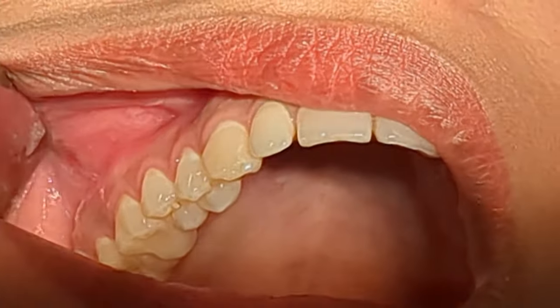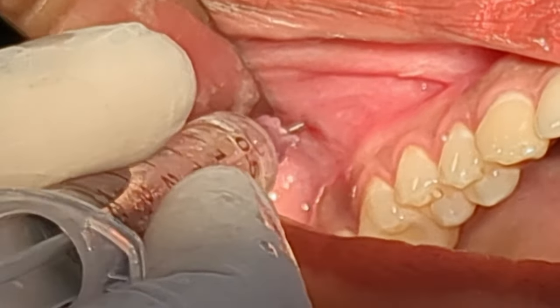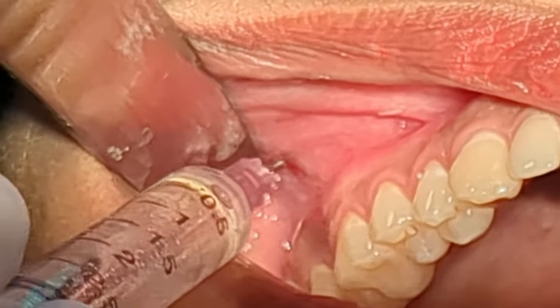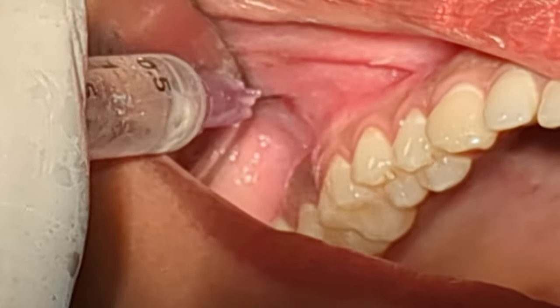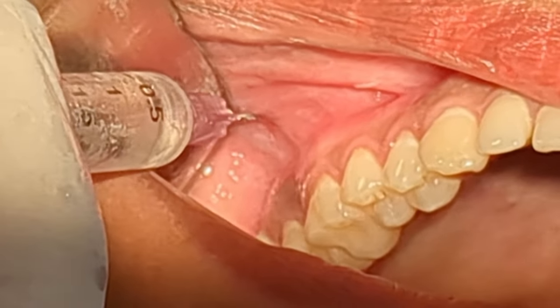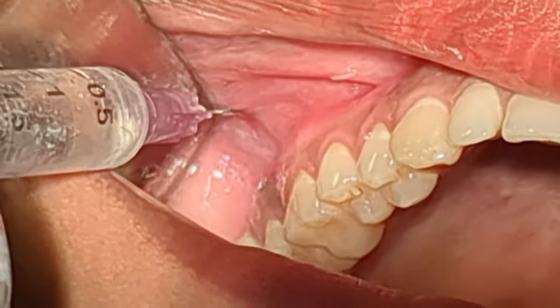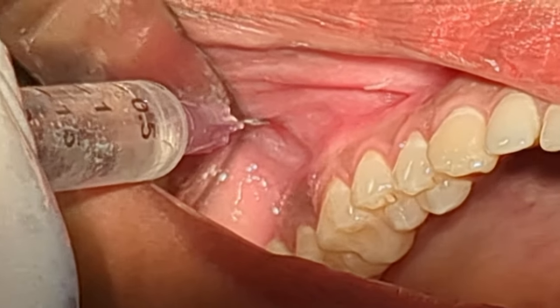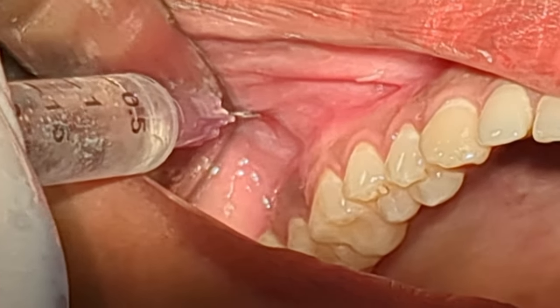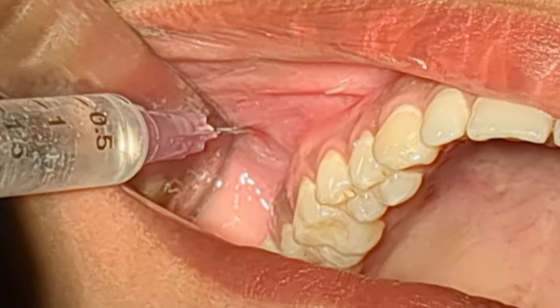The depth of insertion is 16 mm in a normal average adult individual. Depending on the skull size, you will have to reduce or increase the amount of LA to be deposited. You can see the needle is at 45 degrees to the occlusal plane.